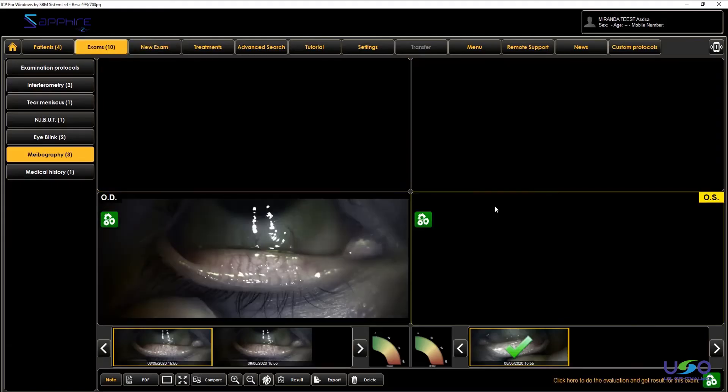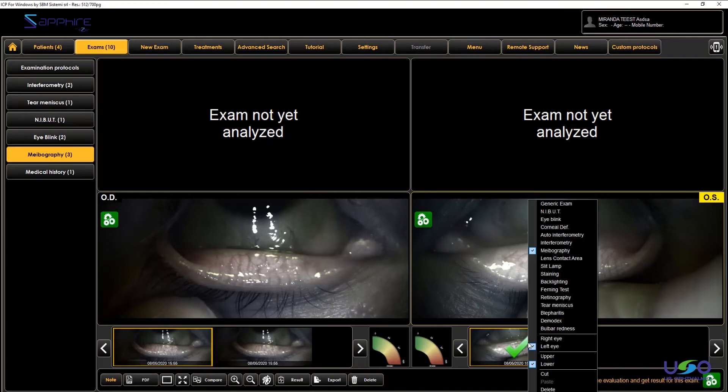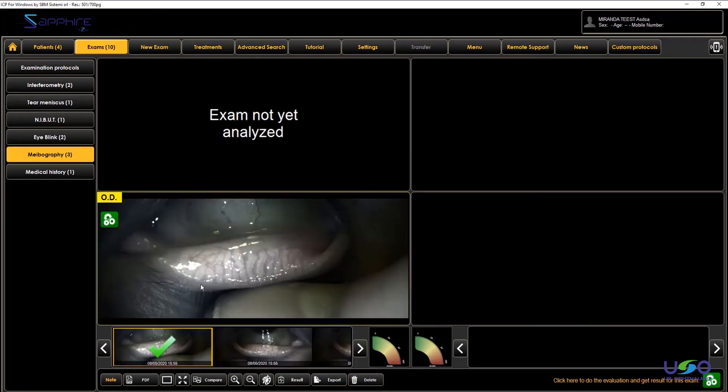Remember that any picture you take inside the software can be moved and shifted within the patient records and inside the same patient. For example, I want to say that the picture we took is not a left eye but a right eye. If you right-click on it, you can change the kind of examination you recorded, or you can just change the eye. The software will shift the picture to the correct side.